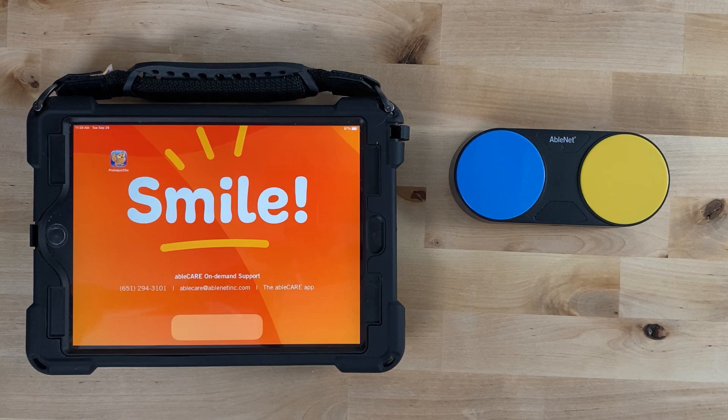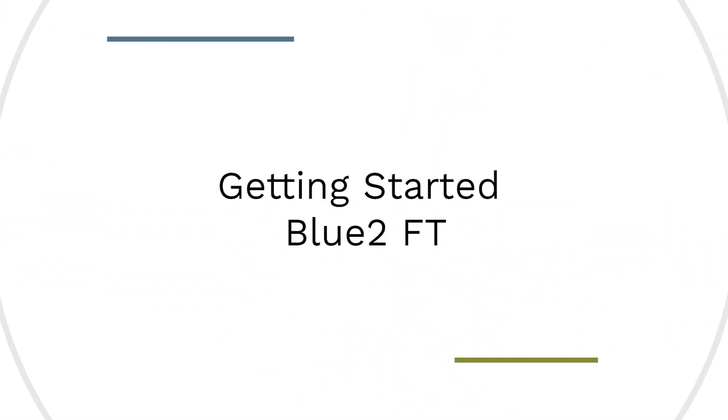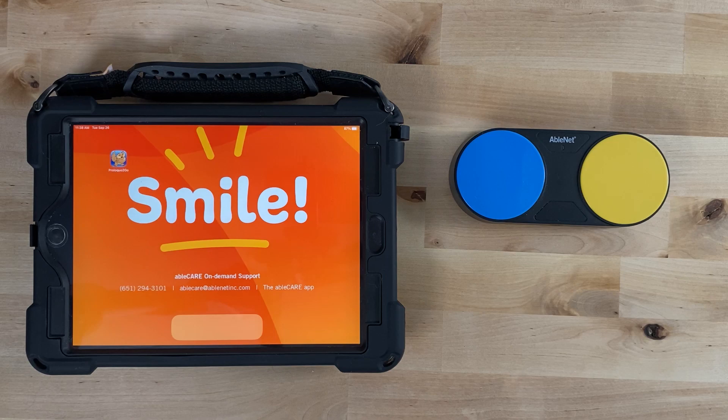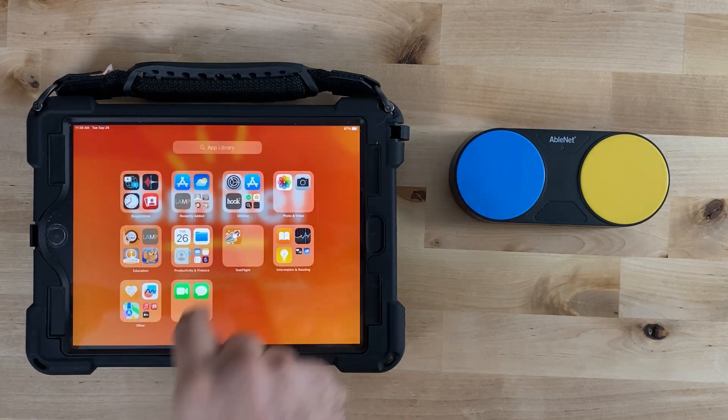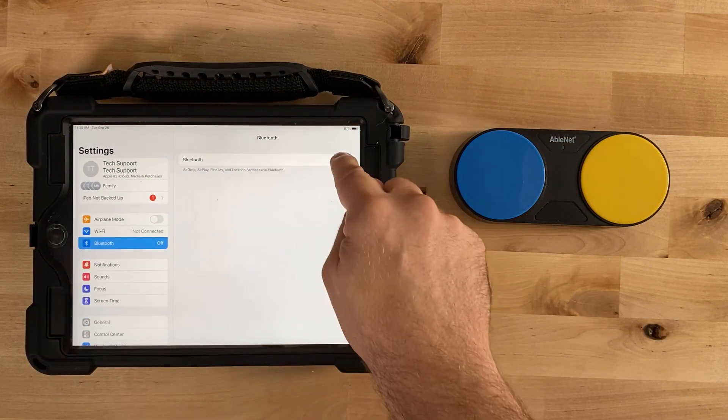Hi, I'm Jim from Ablenet and today I'm going to show you how to get started with the Bluetooth Feather Touch. To get started on an iPad or iPhone, begin by going to the Settings app, then Bluetooth, and make sure Bluetooth is turned on.